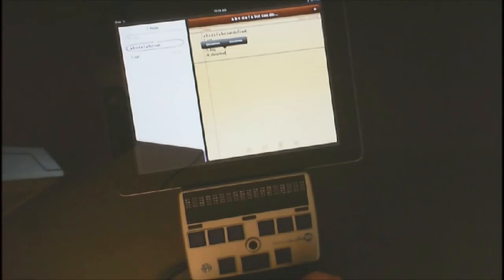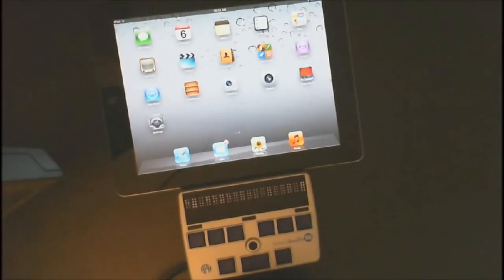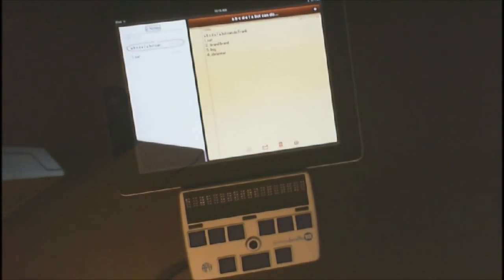Let's go ahead and go back to home — that note is automatically saved for you. When you go back it will be there. In your notes, go ahead and hit Enter, and of course your note is right there. Play around and have some fun.